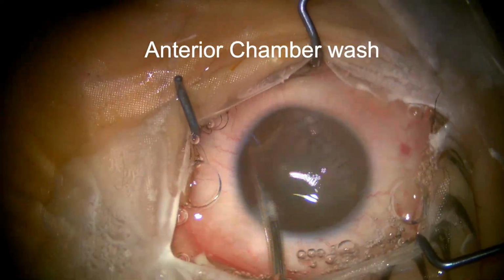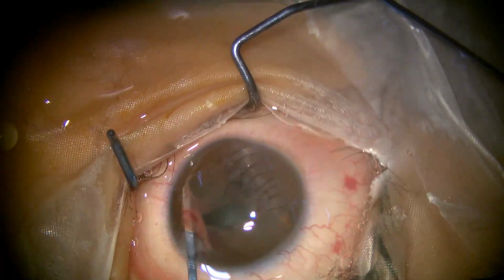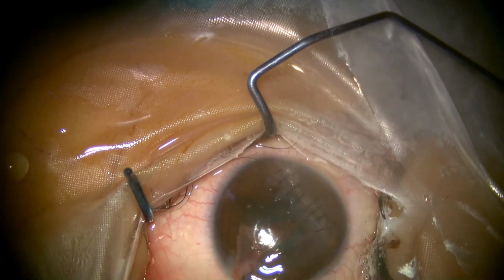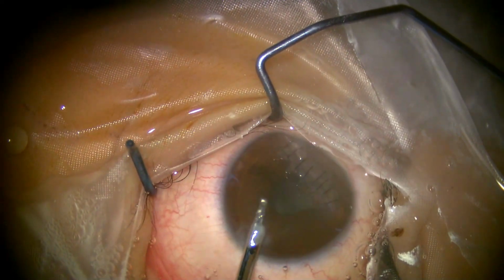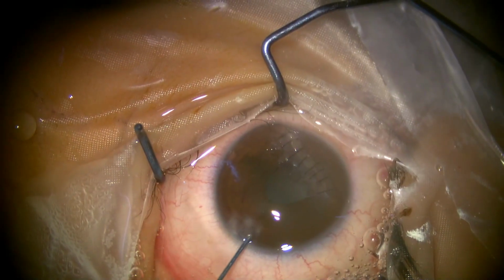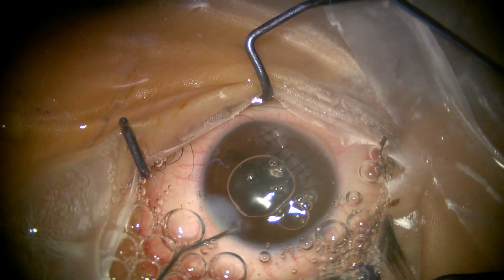Anterior chamber is washed using Simcoe cannula. Here, the membrane of varying density is detected, which is thoroughly separated using iris repositor and finally removed. Anterior chamber is washed using Simcoe cannula and air bubble is injected to form anterior chamber. Side port is hydrated.